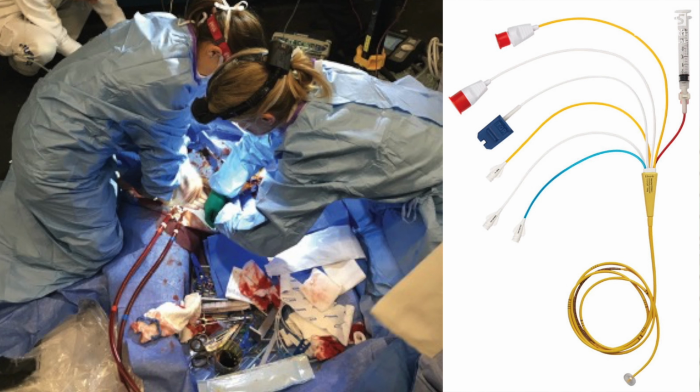If a patient has profound cardiac shock that is refractory to conventional resuscitation or medical therapy, they may be considered for mechanical circulatory support like ECMO. The data from a pulmonary artery catheter helps support this clinical decision, as well as optimising ECMO therapy once it's established. So there are 4 stages to successful insertion and monitoring.